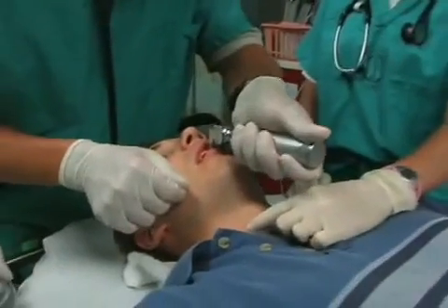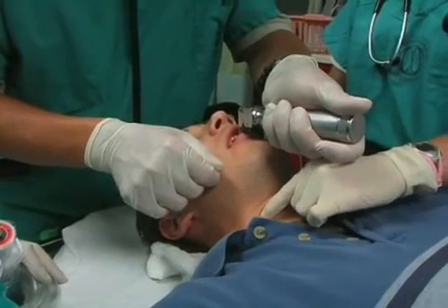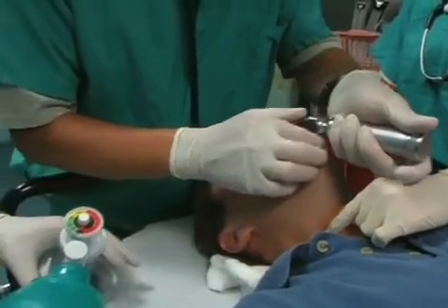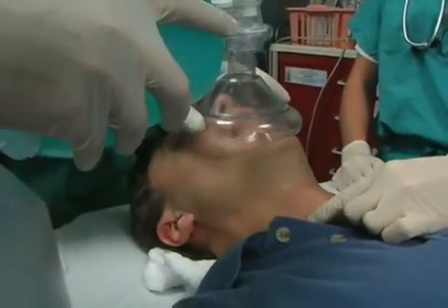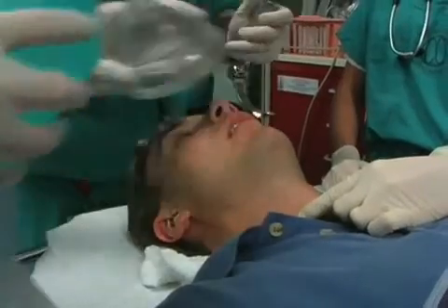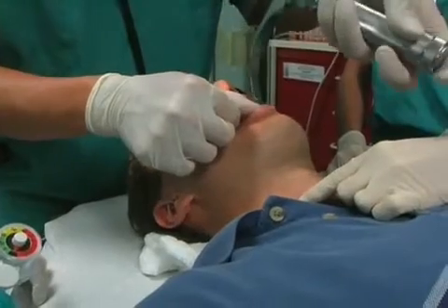If you are unable to visualize the vocal cords, the Burp maneuver may be utilized. This procedure entails manipulation of the thyroid cartilage using backwards, upwards, rightwards pressure, which may bring the cords into view. If unsuccessful, reoxygenation may be required utilizing the bag valve mask device. The operator may consider changing the blade, the tube size, or repositioning the patient prior to further attempts at intubation.